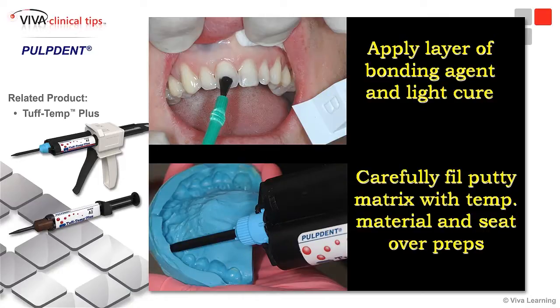We're now ready to go ahead and seat our matrix. We'll go ahead and put some provisional material in. In this case we're using Pulpdent's Tuff-Temp material, which I like a lot. DMG also has a great product — we use that a lot of times too — and Luxa Temp is their temporary material.